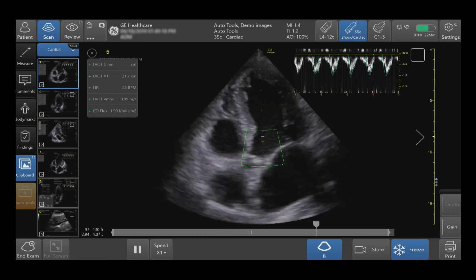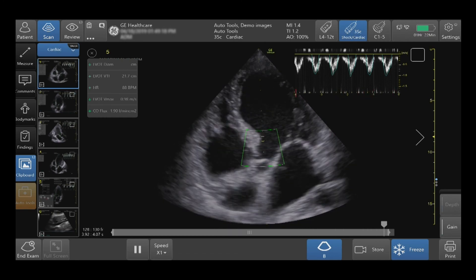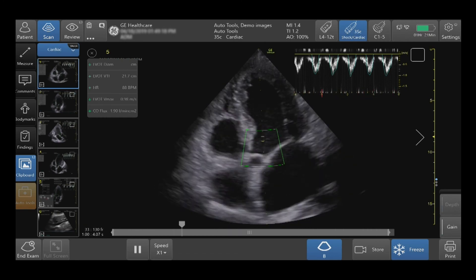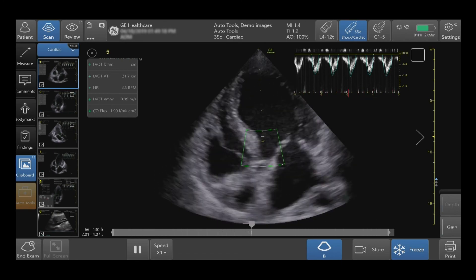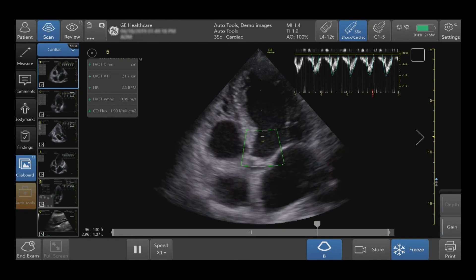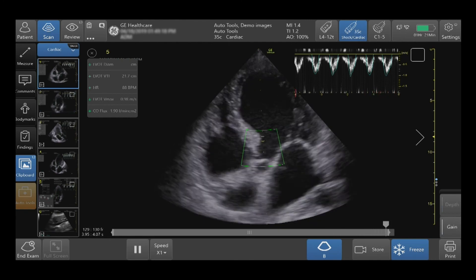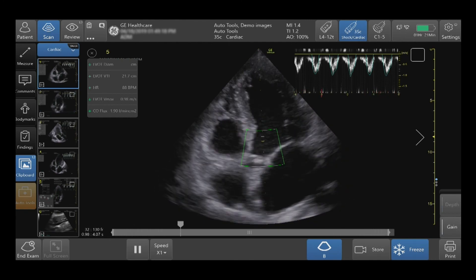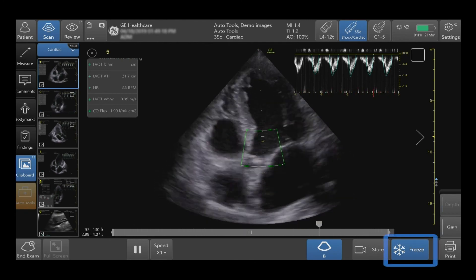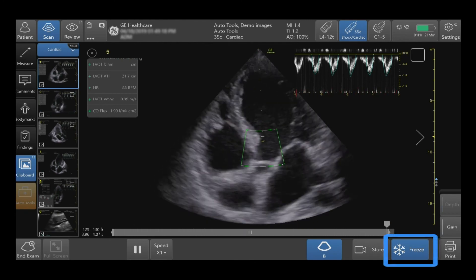When yellow, the results should be taken with caution. When red, no results are shown on the system. If you are scanning live, press freeze.